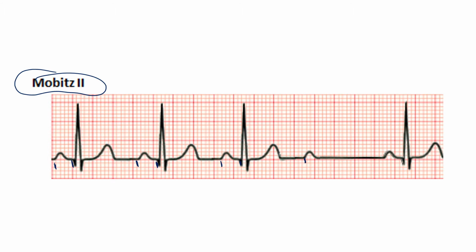And then a PR interval here, and look, nothing. All of a sudden we have a missed beat. And then we go again here to there. Do you notice that all of these distances are exactly the same? But then out of nowhere, you have a dropped beat.